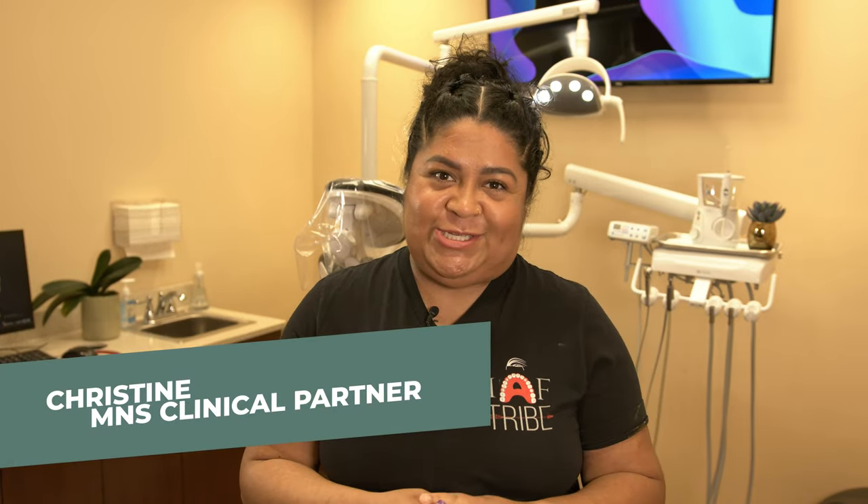One of the most frequently asked questions that we get is: how do I clean my bridges? I'm here to show you the exact instructions that we give to our patients on the daily. I'm going to start from immediately after surgery to the moment that you get your final teeth.